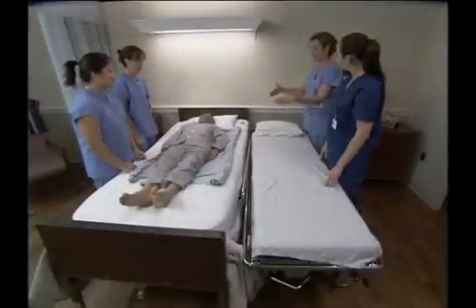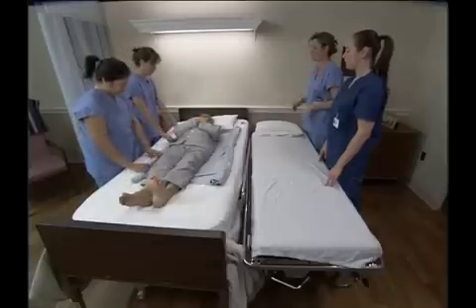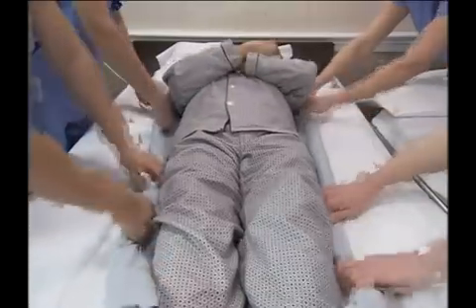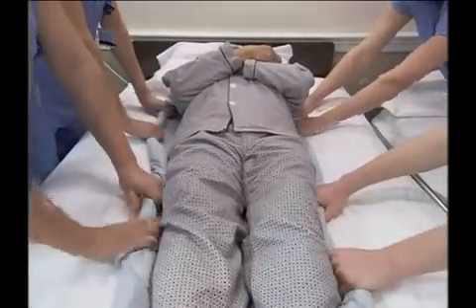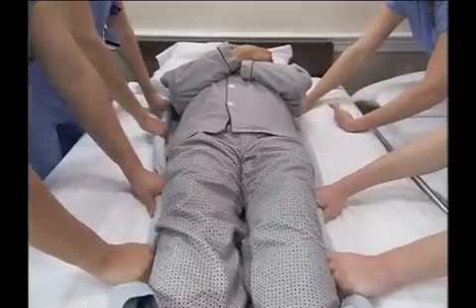As shown here, 2 assistants stand on one side of the bed facing their co-workers, who are positioned along the outside edge of the stretcher. All 4 assistants should grasp the edge of the lift sheet and roll it over as close to the person's body as possible. This will provide for a better grip.